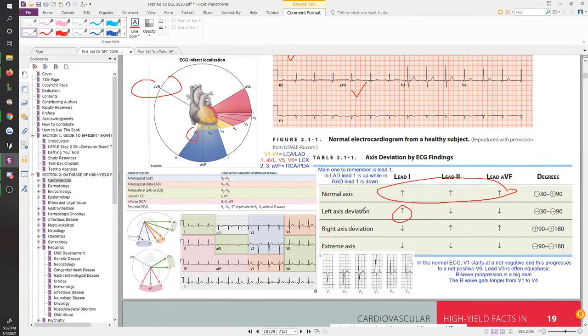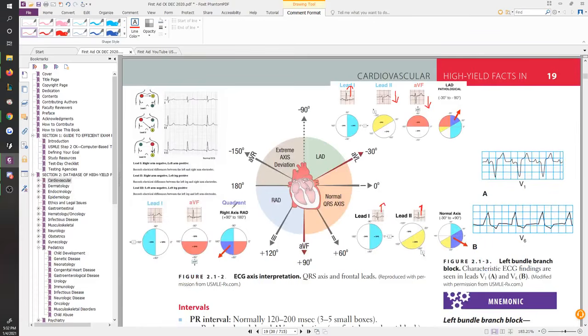Same simplicity for the right axis deviation as well. What happens in a right axis deviation is your lead 1 is actually the only one pointing down. Okay, so if I keep to the same circling, then yeah, those two guys are pointing up and lead 1 is not. So let's take a look at the right axis deviation. That's this image over here. They show you in comparing to normal. Remember that in normal, lead 1 had the blue area on the right side. Now you can see it's the opposite. The blue area moved over to the left.